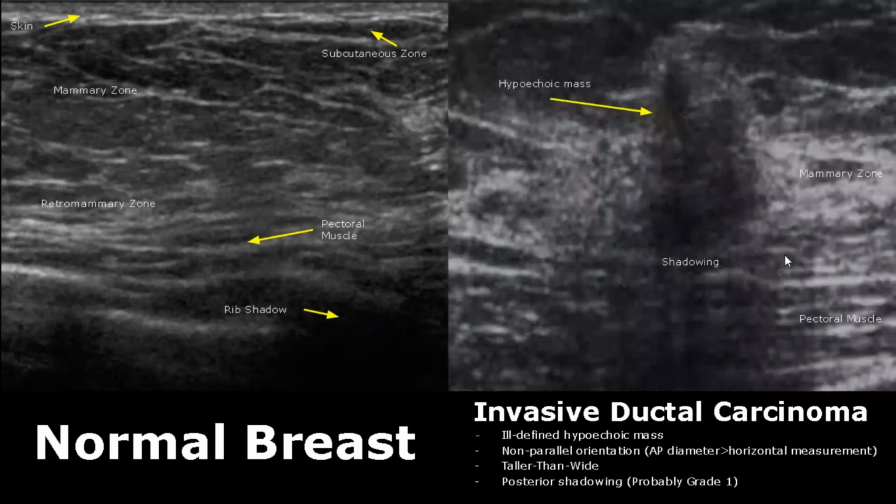Here we have another case of invasive ductal carcinoma. We have an ill-defined hypoechoic mass and it has a non-parallel orientation. It is taller than wide. The AP diameter will be more than the horizontal measurement. It also has posterior shadowing, which is usually a sign of grade 1 invasive ductal carcinoma, but it is not always the case.